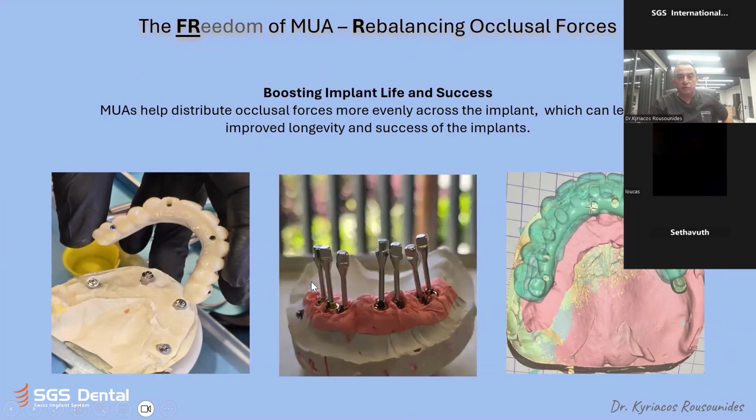So these angulations are in the first impression, directly after the surgery. This is the scanning of our technician. We see the position of the implants and the multi-units, and this can also be corrected before the final restoration.